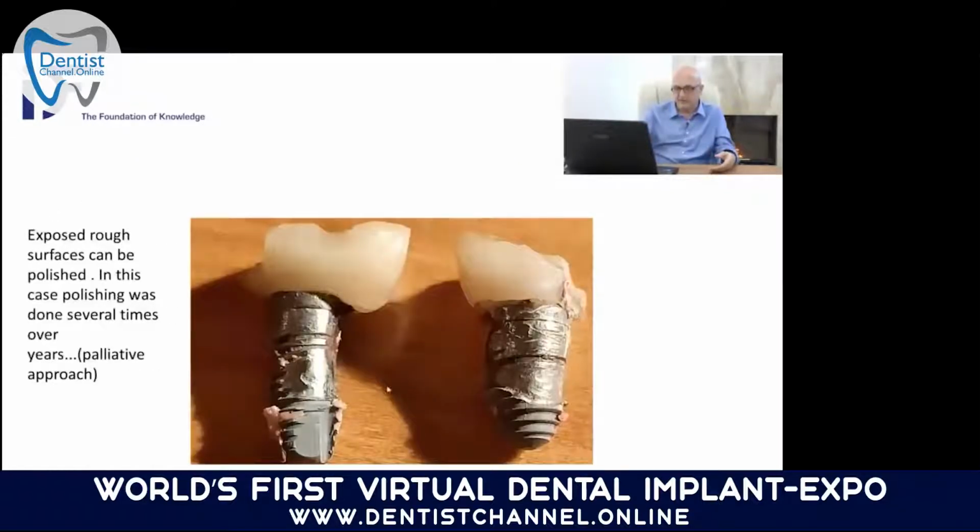Now here's such a case, two implants which I took out recently in one of the clinics where I work. This is a screw implant, so this was a screw implant surface up to here. It was all sandblasted, acid etched, you know, the latest technology. But of course, periimplantitis happened. This is after 5 years. And as you can see, the doctor was then desperately trying again and again to polish the surface to stop the periimplantitis.